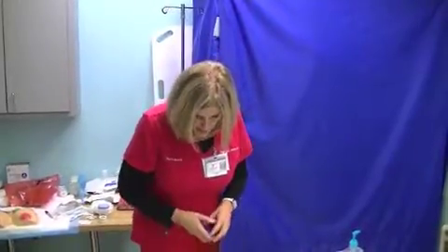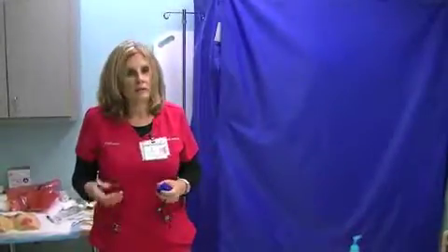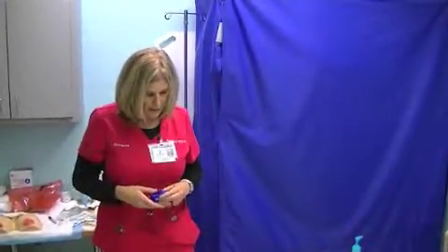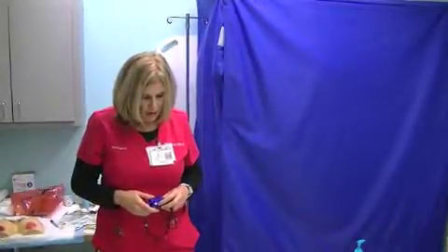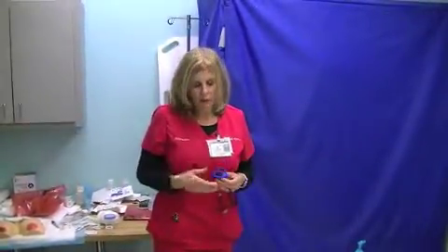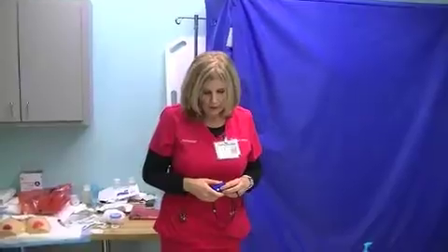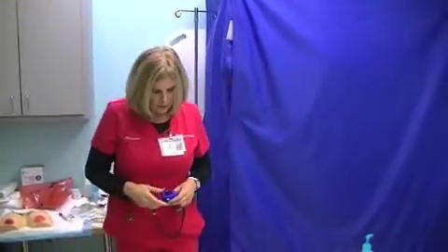So the patient needs to have accurate circulation for the hemoglobin to be able to absorb the emitted light, to be able to get a proper reading. If we're using one that has adhesive on it, we make sure the patient doesn't have adhesive allergies. Okay, so now we choose the appropriate sensor because we're going to do a fingertip reading.